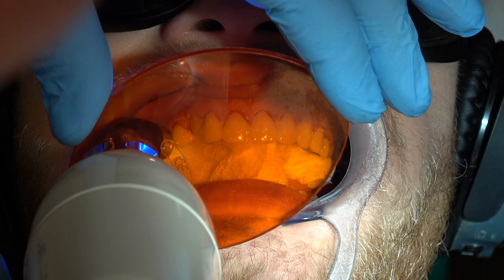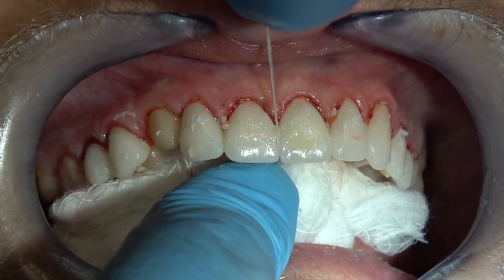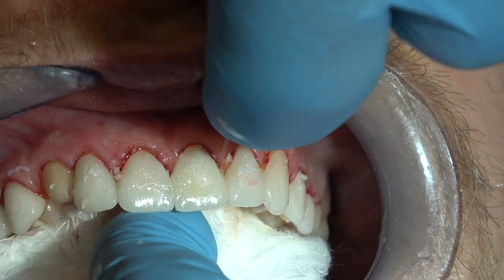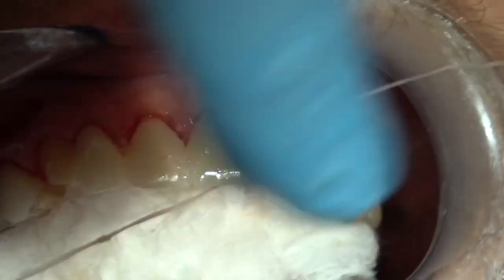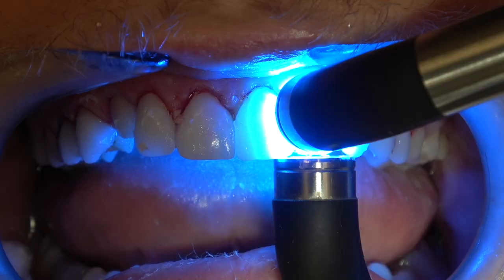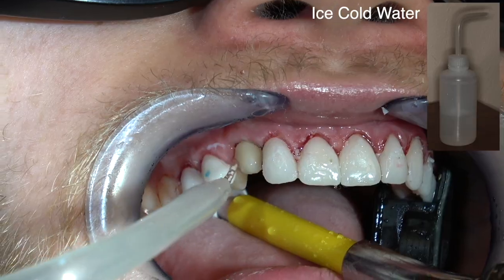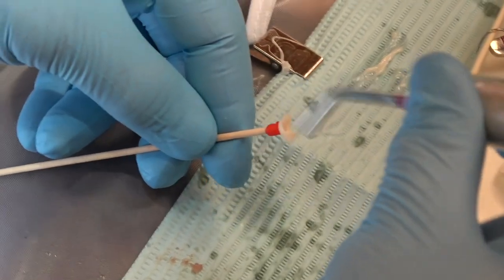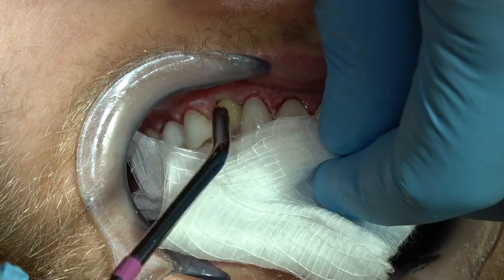So I had some issue with that cuspid, so I took that one off, cleaned it, and seated it separately. Then I'm going to go back and cure these 60 seconds on each side, going through the same process again. I don't know that I've ever had this happen, but that tooth was kind of oddly shaped, and I had a little trouble with the seating of that veneer. But if you do, don't panic. Just take that off and seat it again. I think this is the only time I can ever remember having trouble with a veneer seating. It had something to do with the angle of the tooth.